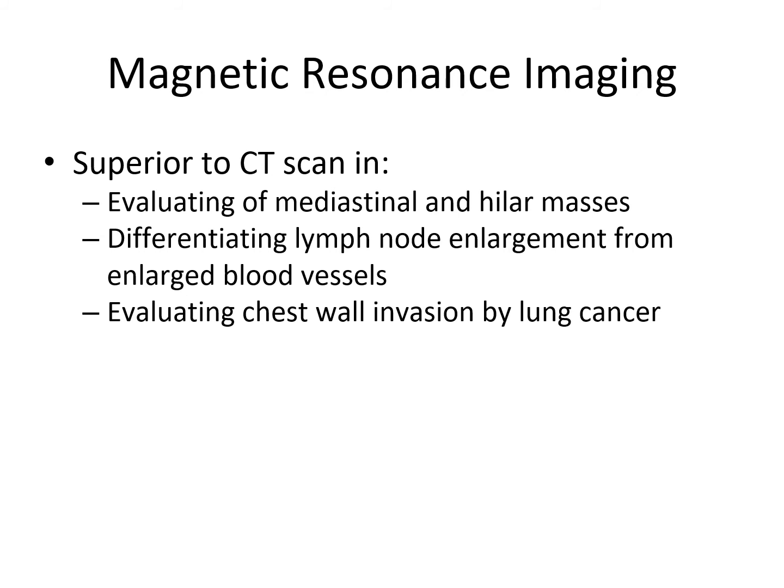Definitely useful in looking at chest wall invasion of lung cancer. Another thing is they'll take patients to look at their brains with the MRI. They actually use the CT and PET scan more so for lung disease, but they can use the MRI. I know they use the MRI a lot for the brain and for the belly.